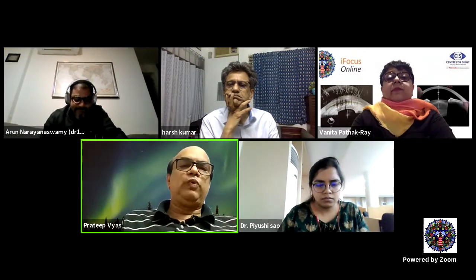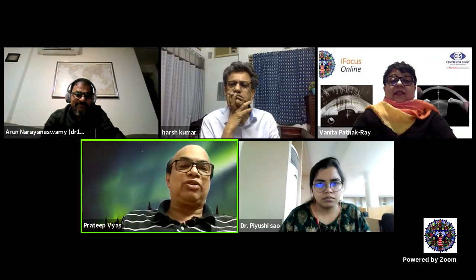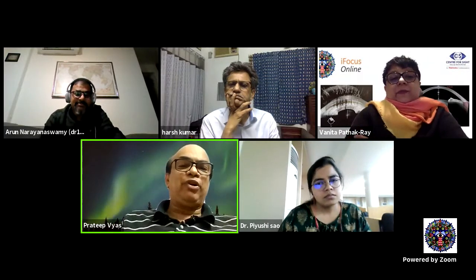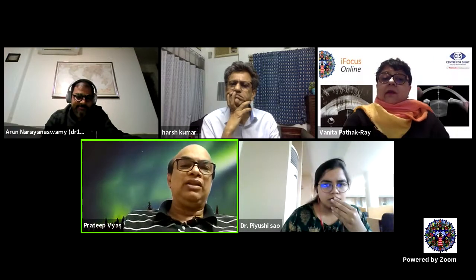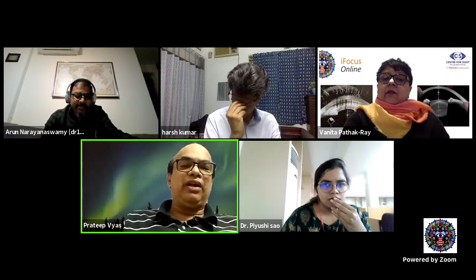Arun, you were my first teacher for teaching the Visante. At that time, we used to discuss a lot about the iris thickness and the lens vault and so on and so forth. You had the software and you did share it with me. So what's your take? Because angle closure glaucoma is also a continuum like open angle glaucoma, where you can pick it up at a very early stage where the iris thickness is more and the lens vault is very significant. What's your take on that?